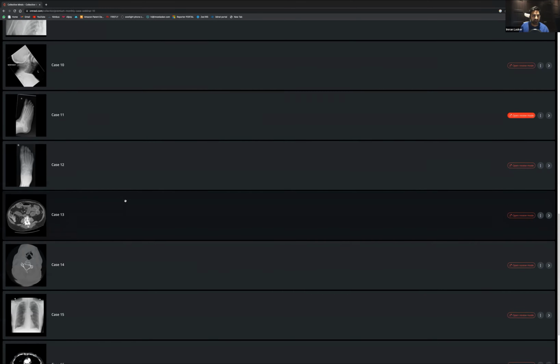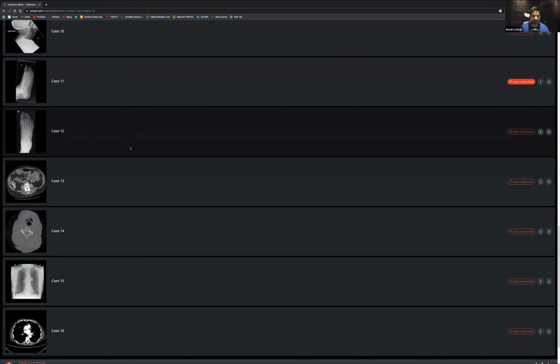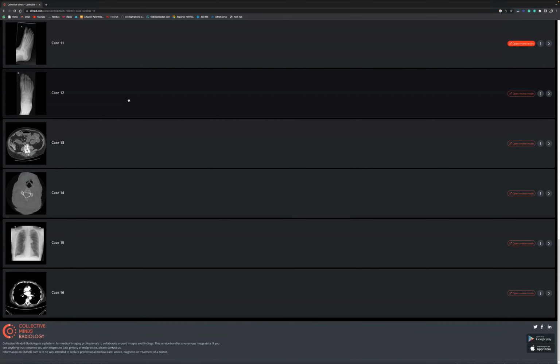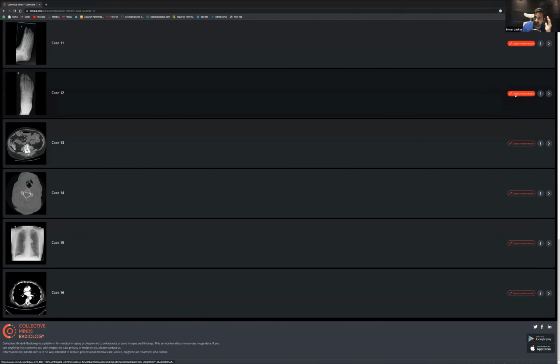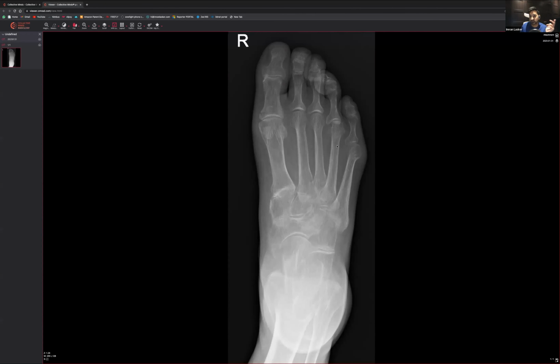Right. I feel like we're running on time. Okay. I think there were a couple of questions in the chat. I've answered that one, and you're right about that one. With the calcaneonavicular coalitions, I'd be very, very careful, especially if you don't have a dedicated view of the area, because you get so much overlap. You really need a good view of these things. And sometimes you need to confirm coalitions on CT. There's just no other way to do it.